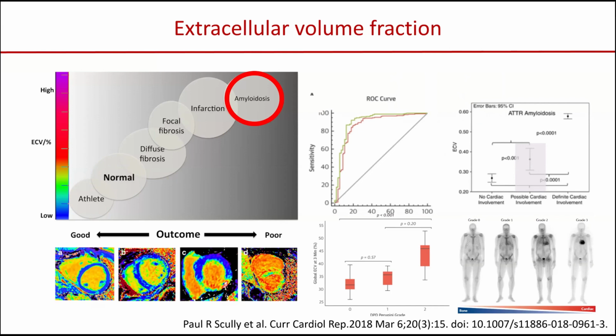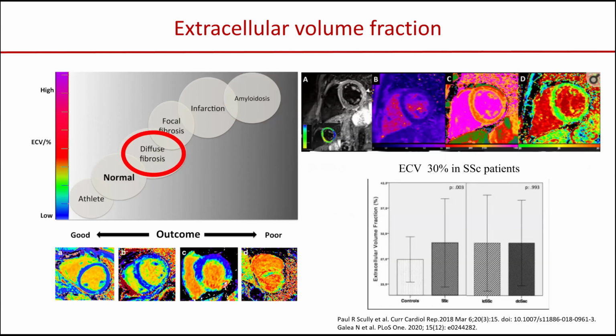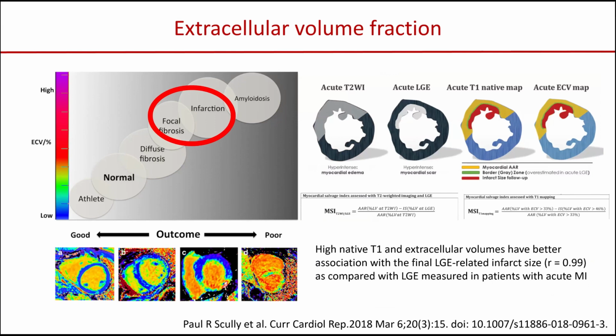So it has both diagnostic and prognostic value. The diffuse fibrosis was demonstrated in different settings, both in the hypertrophic and dilated phenotypes. Obviously, we can also observe a strong increase in the ischemic cardiomyopathies, with the capability to provide a characterization of the enhancement, but using only the ECV assessment.